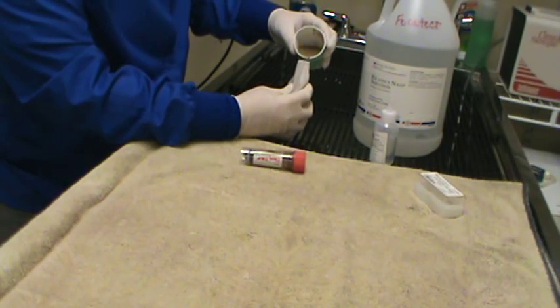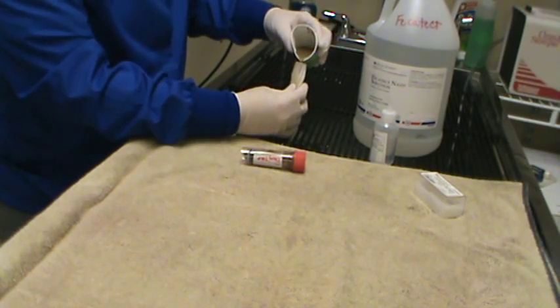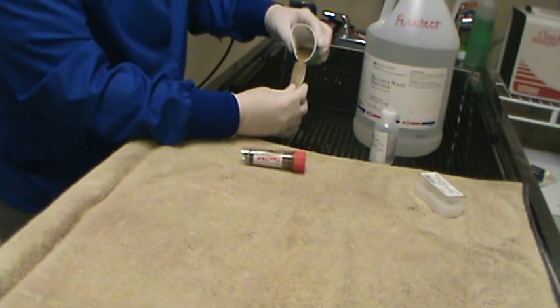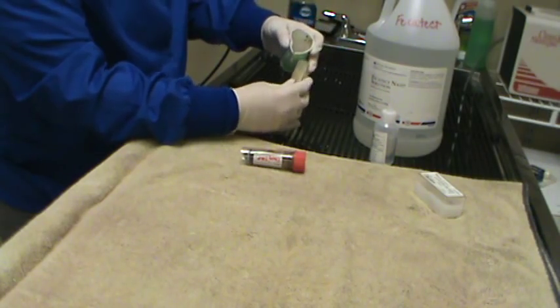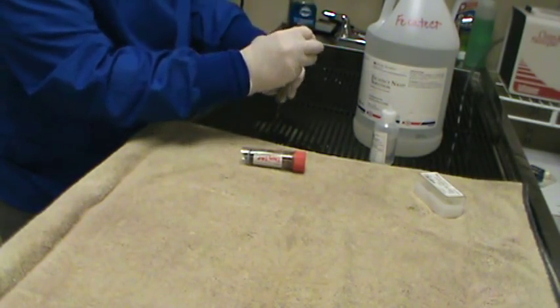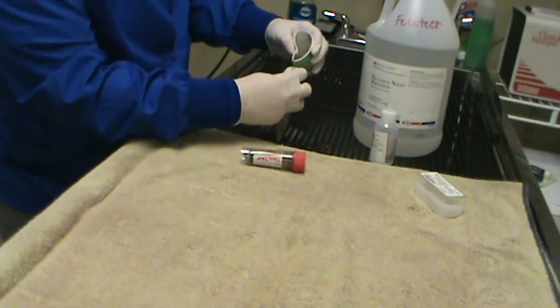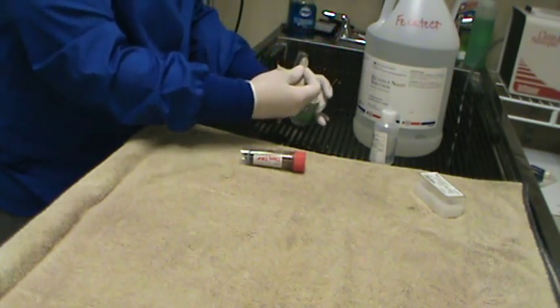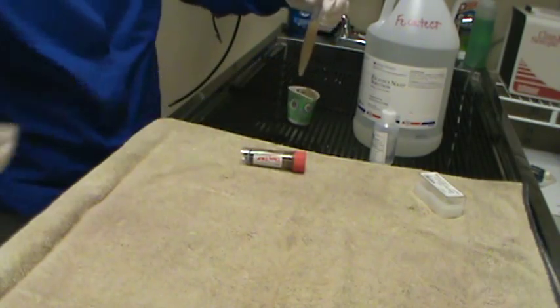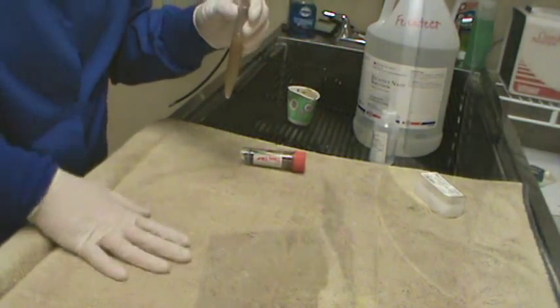I'm straining it through — I'm going to fill it about halfway. The cheesecloth has moved on me here. So we have a sample collected here about halfway full. And we're going to go over to the centrifuge and start spinning it.